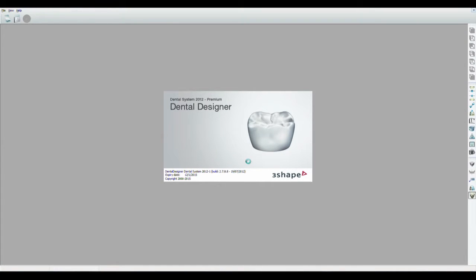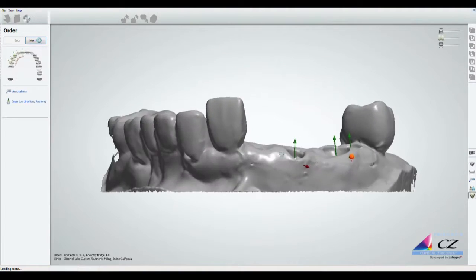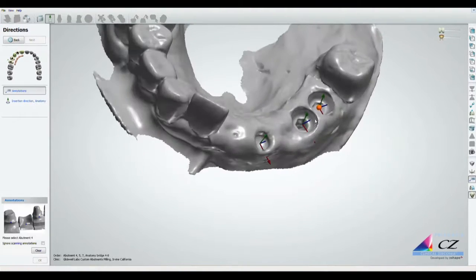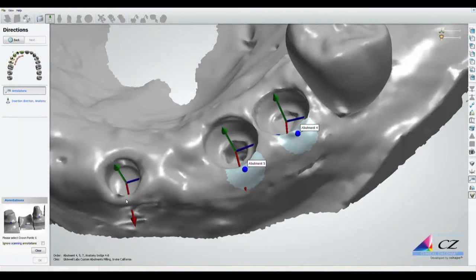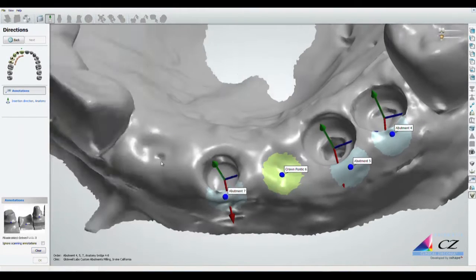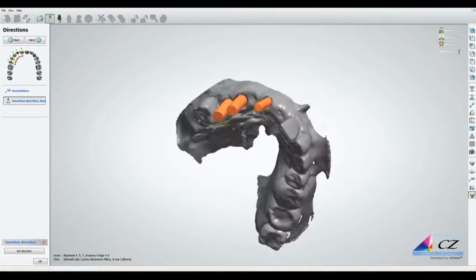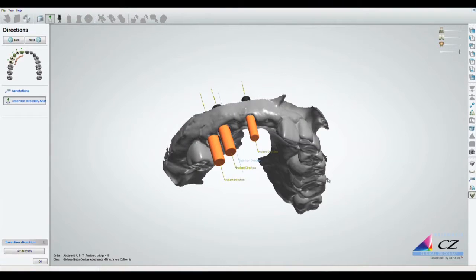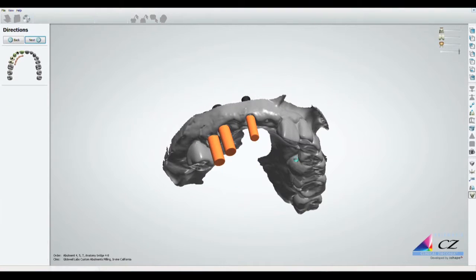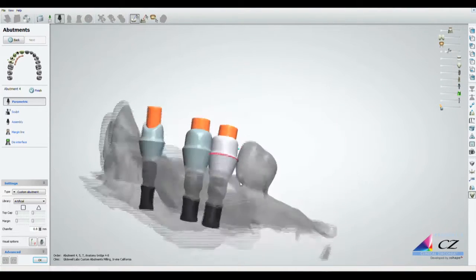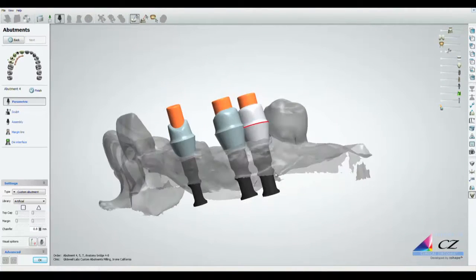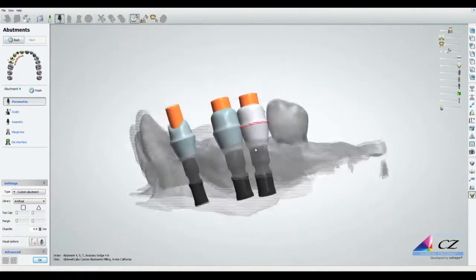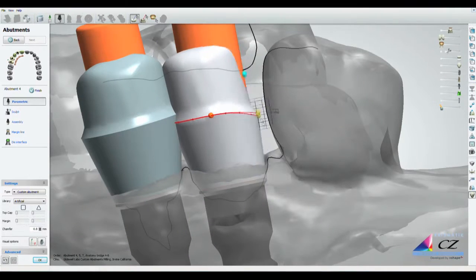To start the CAD process, our technician uses dental CAD software to design the screw-retained BioTemps bridge on the virtual model generated from the scans. As with any implant case, we start with the path of insertion. Once this is established, we can build the substructure of our bridge.